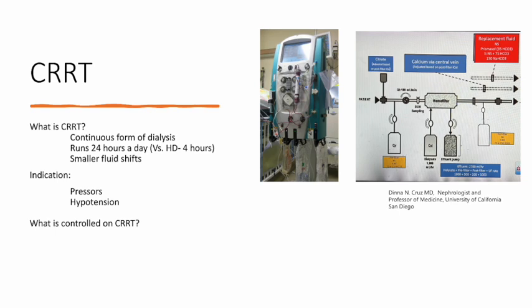So what's the mechanism of CRRT? Well, the mechanism is actually complex, but the summary is that in patients on CRRT, blood flows continuously from the patient through the CRRT machine and passes through a filter. And in the filter, a gradient is created using dialysate solution. And via this gradient, electrolytes and fluid are removed. And by deciding which dialysate to use and what fluids to give back before the filter and after the filter, as well as which Prismasol solution to use, which is the solution that's given back to the patient, you can control the fluid balance per hour as well as electrolytes.